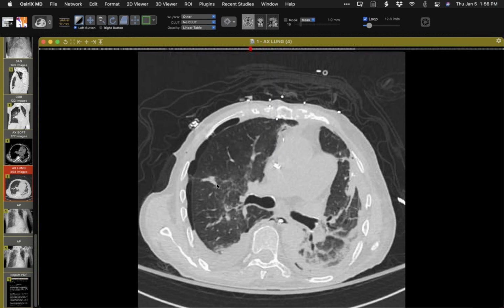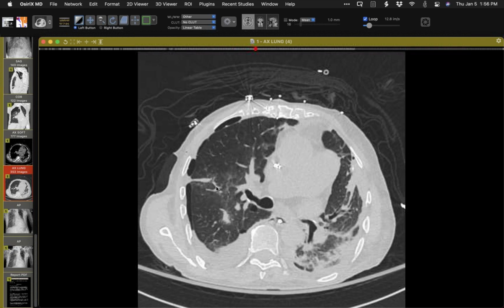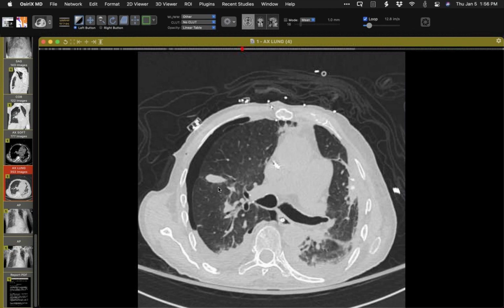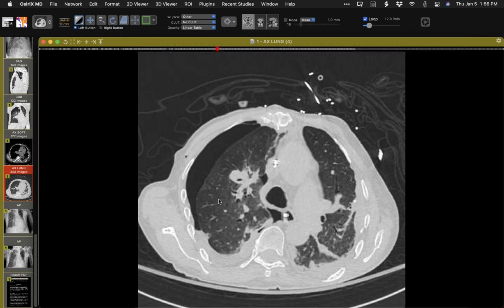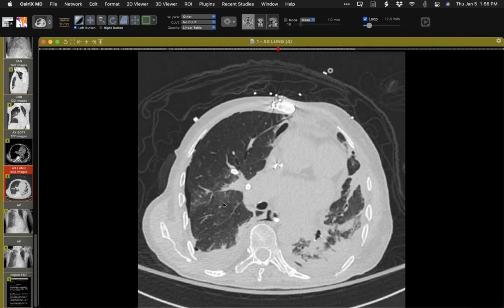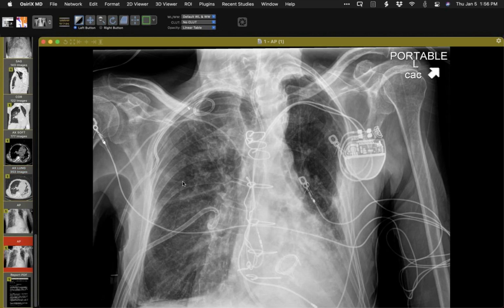So in spite of the fact that these catheters are relatively soft, maybe because of adhesions, sometimes they're hard to place. And even though they're soft, they can go into lung. And this person had 2 of them on 2 separate occasions going into lung. This one was taken out eventually, and here it is, still there, but our people put in this one up here, and then this one, which is in the right middle lobe, was taken out.